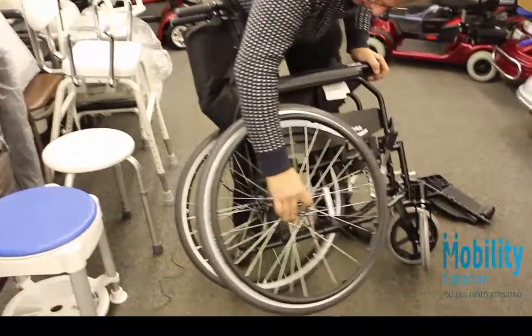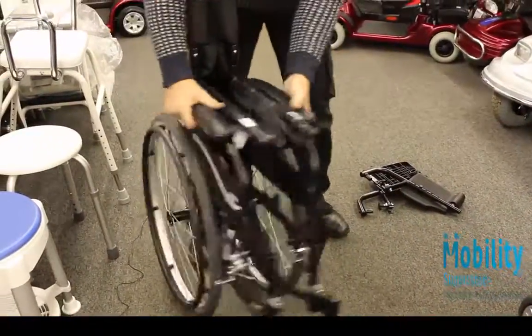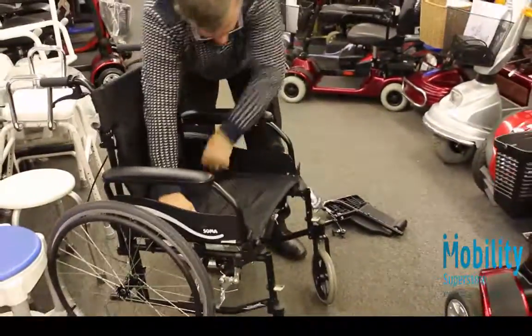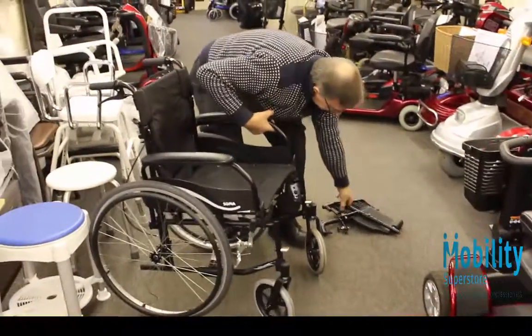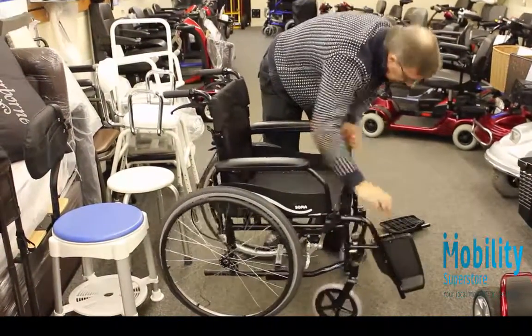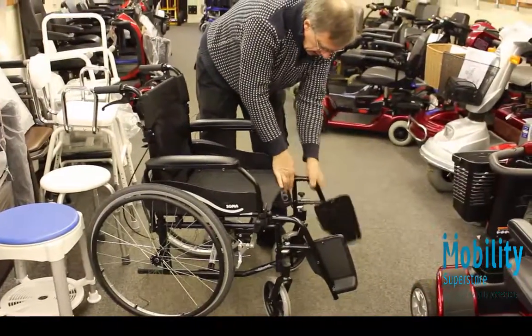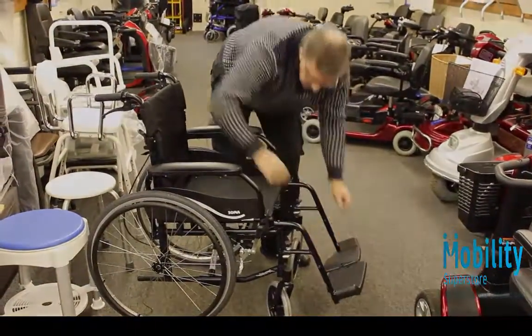Open it up and what you need then are the footrests, which are called swing away for obvious reasons, and away you go.